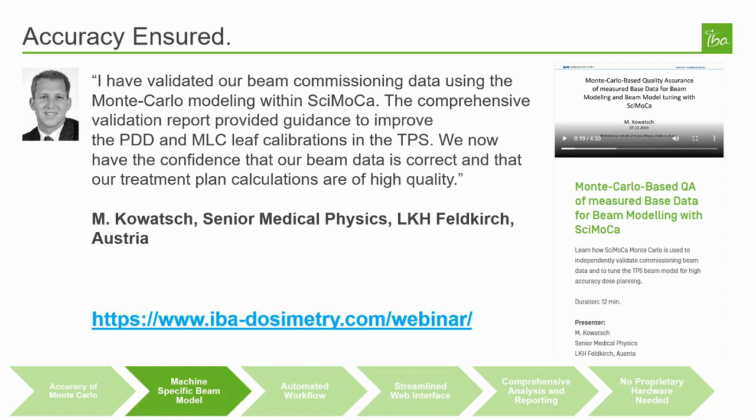We now have the confidence that our beam data is correct and that our treatment plan calculations are of high quality. If you would like to hear more details about the experiences of Matthias Kovich, then I invite you to hear his webinar where he discusses the details of his experiences working with the base data and beam modeling of SciMoCa. To access the webinar, please go to the webinar section of the IBA Dosimetry webpage by typing the URL shown on the screen.